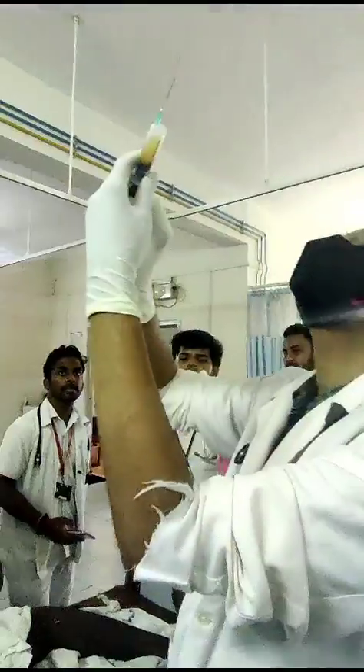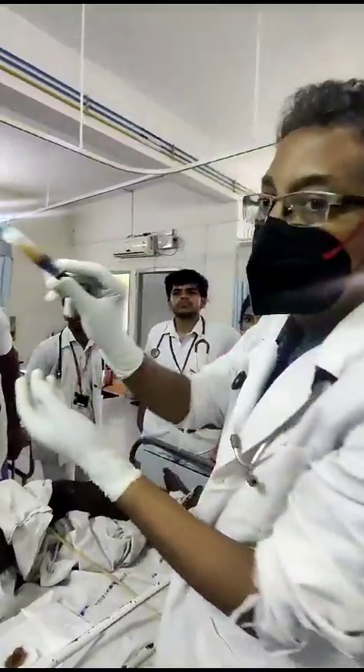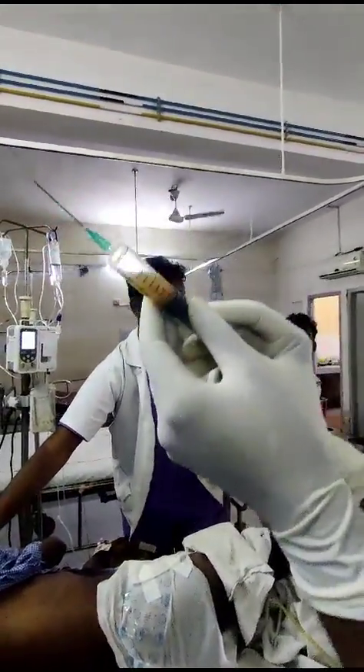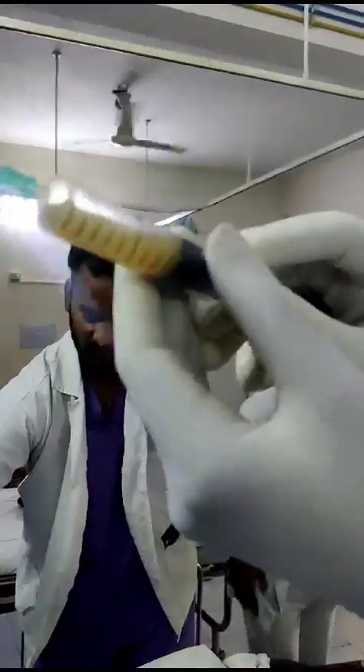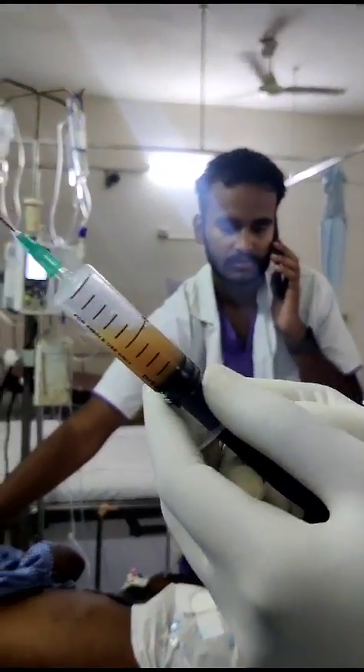Yeah, not much, but you see it looks a bit exudated, you know, like pus. See, it is looking like pus. It is not very clear. Very much like pus. Serosanguinous — we call this. It is a very typical serosanguinous fluid.